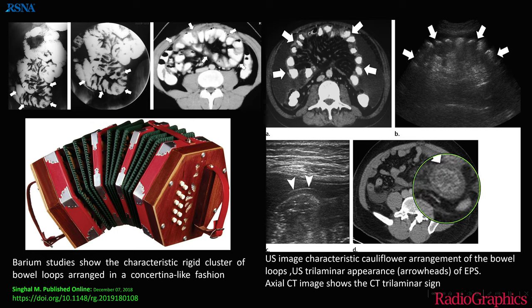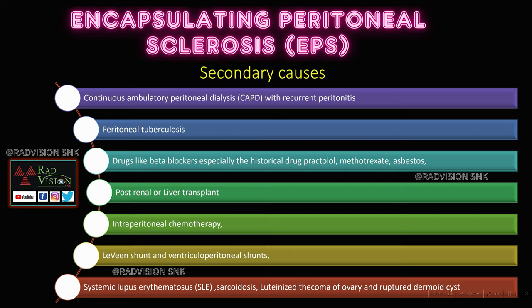This is the CT equivalent of the trilaminar appearance, in a classical case of EPS — encapsulating peritoneal sclerosis — taken from RadioGraphics.